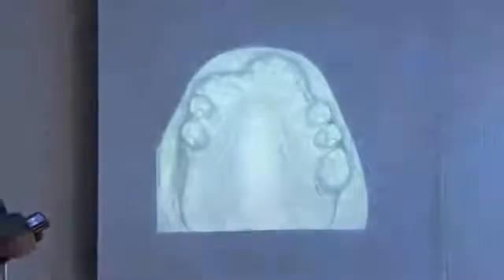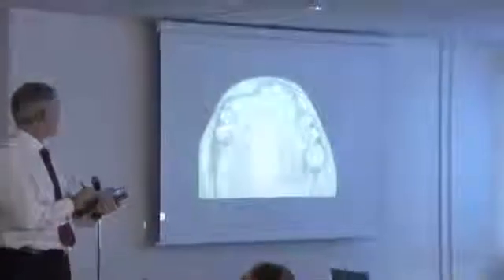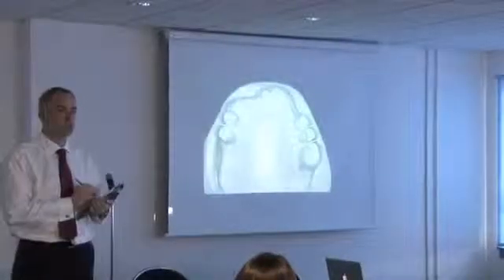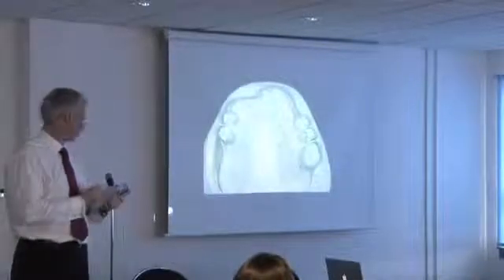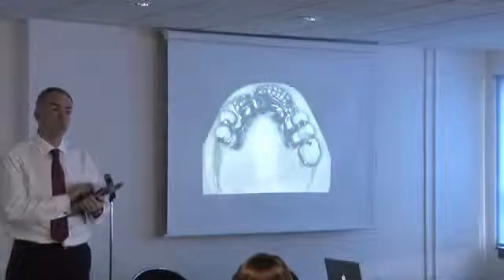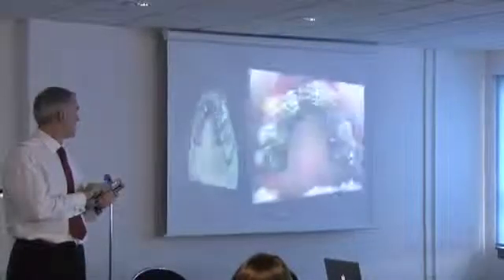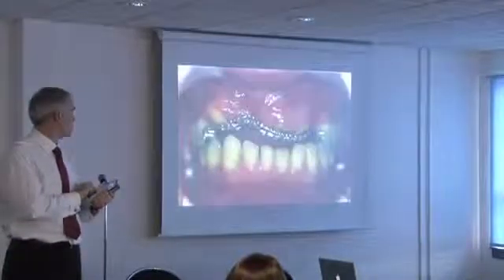And you'll see there are some pretty big gaps appearing here. There's a big space appeared here. There's a big space appeared here, courtesy of my high speed. And then I've cut some pretty meaty rests. Let's see what happens with that. This is the denture that we produce. We'll try it in as an overdenture. Check from the front.